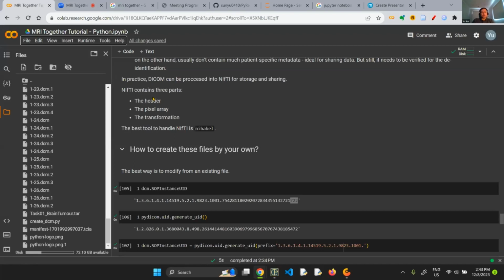And if you use simple machine learning like sklearn, what I mean by simple or traditional just means before deep learning, say logistic regression or XGBoost, things like that, you can use sklearn and that supports NumPy natively. Well, I'll stop here and see if there are any questions or discussions we can have.